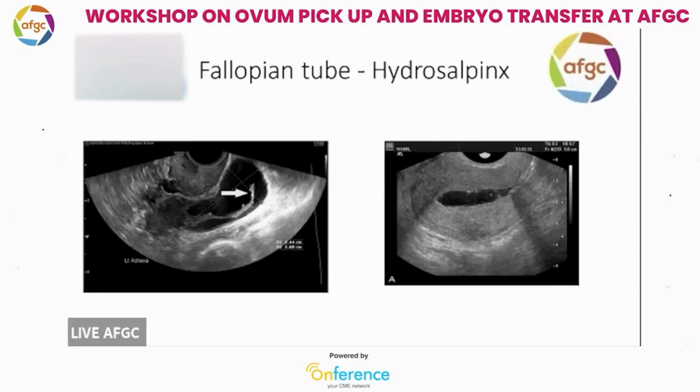The follicle will only develop during the early follicular phase, increase in size and collapse after ovulation. So, if you are doubting whether it's a cyst, especially if it is clear like a dominant follicle, then you have to repeat the scan over a period of time to confirm that.